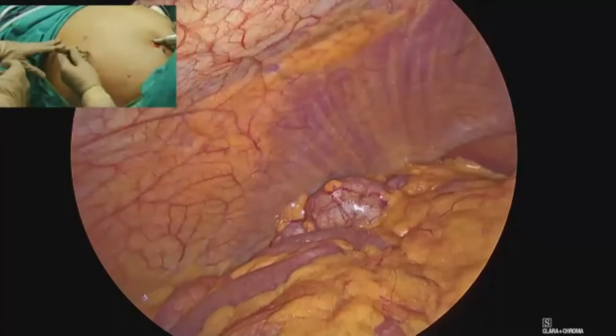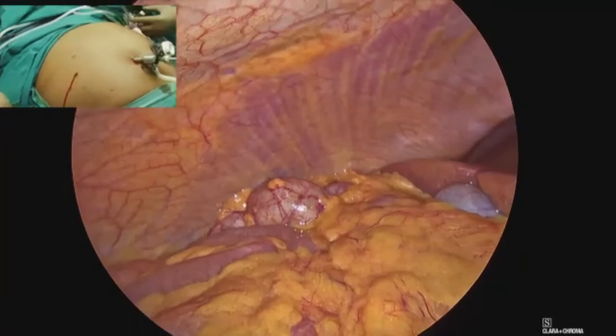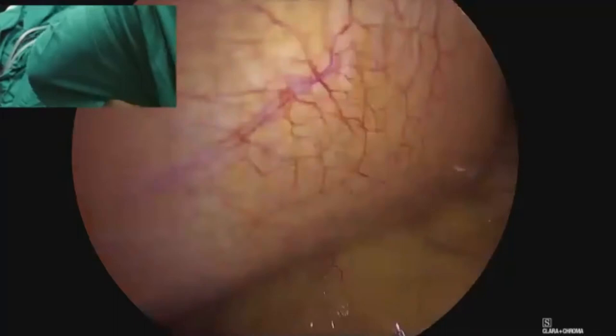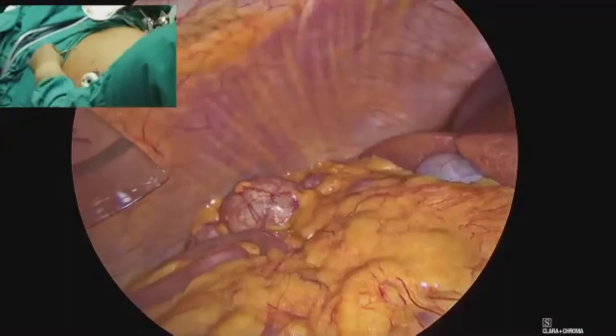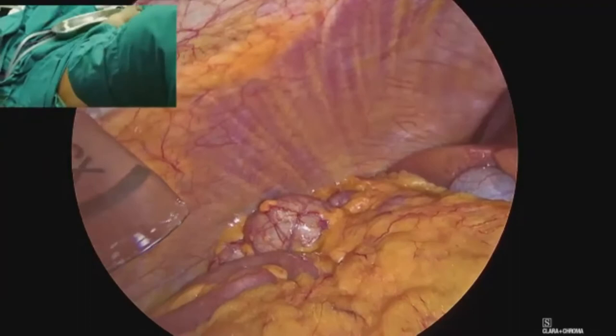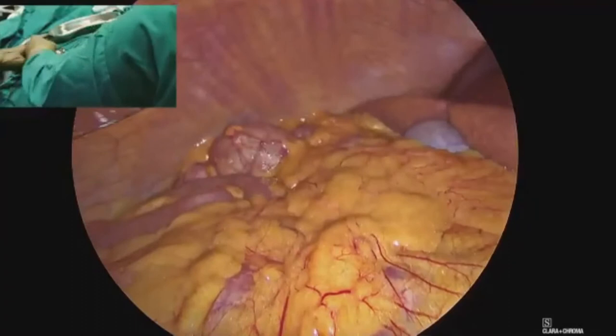Just to give you a brief recap, we had an endoscopy which turned out to be normal. We had no gastritis. The GE junction was fine. It was at 40 centimeters, no esophagitis. We had a nice pre-pyloric area with the pylorus open, no bile in the stomach. The duodenum first part, second part looked normal. While putting the scope in a retroflex position, we could not find a hiatal hernia. So almost a normal endoscopy like we expected.